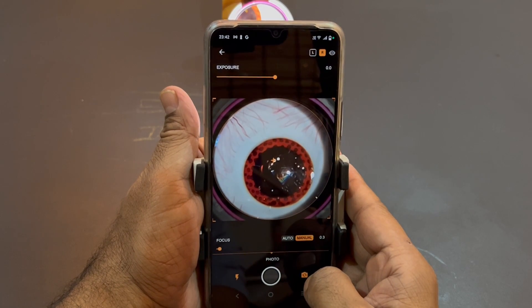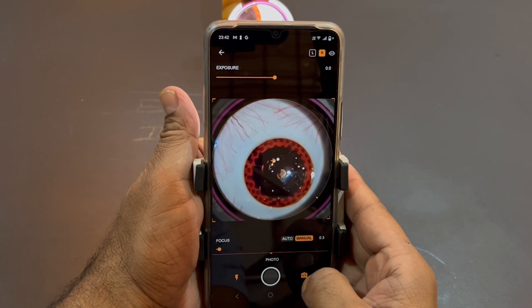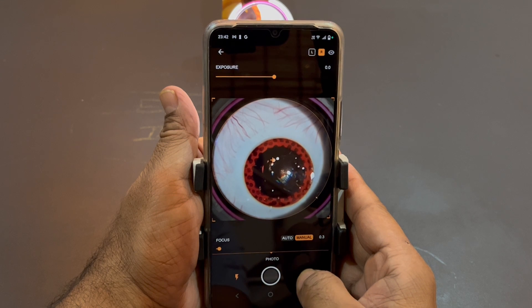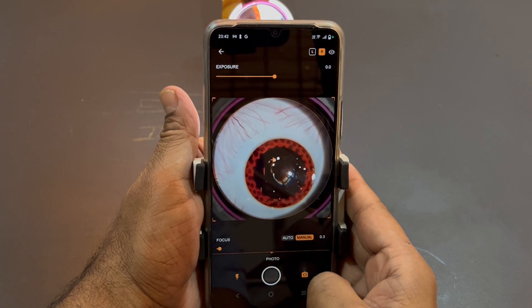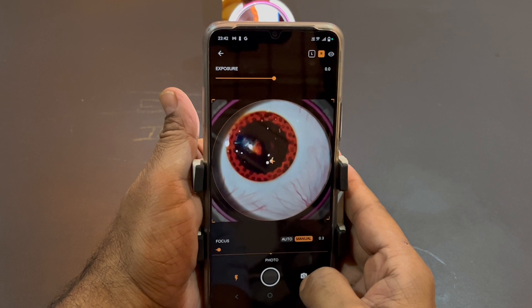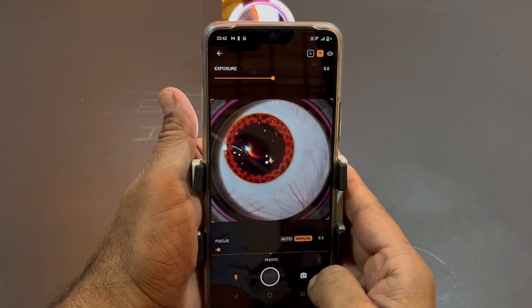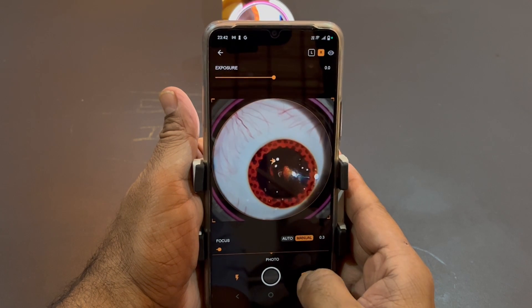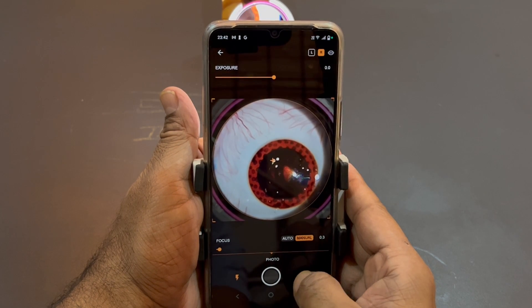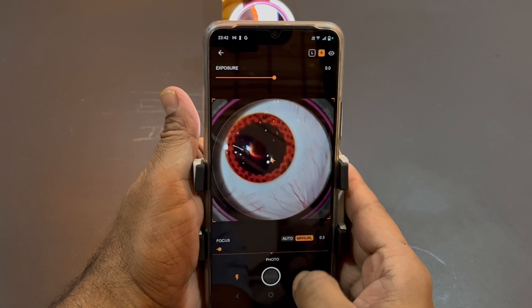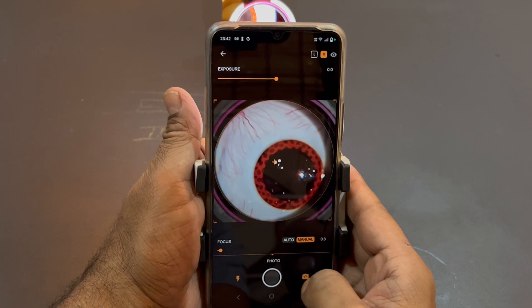Because a 20-diopter lens is used, the image can be inverted. If you are sitting in front of the patient, your images will appear inverted, so you can use the flip option to correct them. If the patient is lying down, you can keep the images as they are. This option just makes things a little easier.